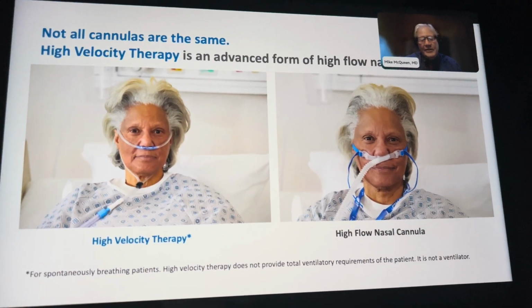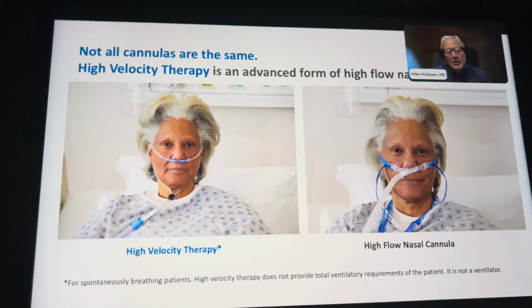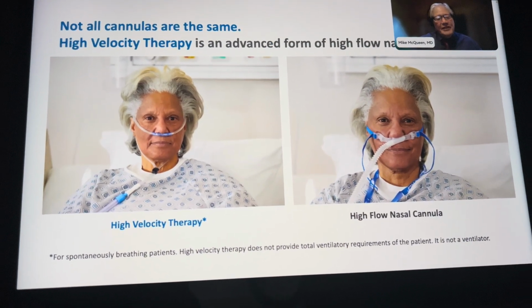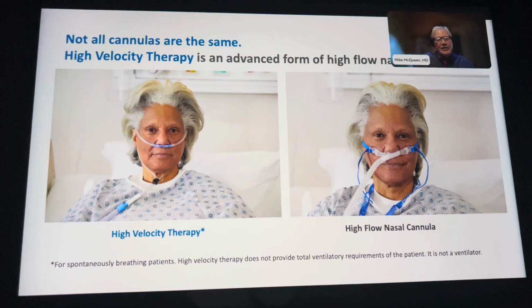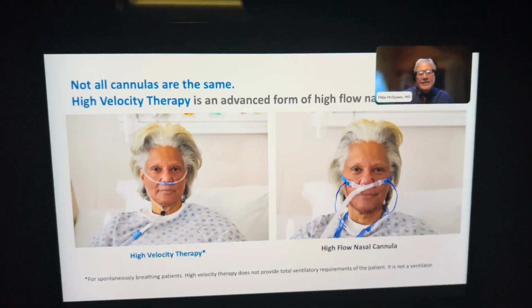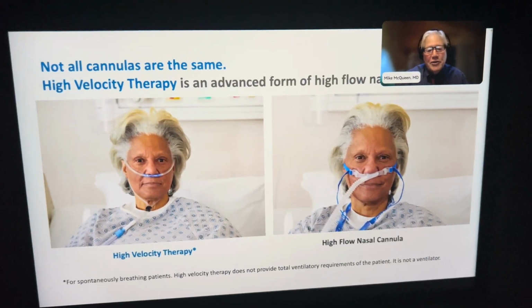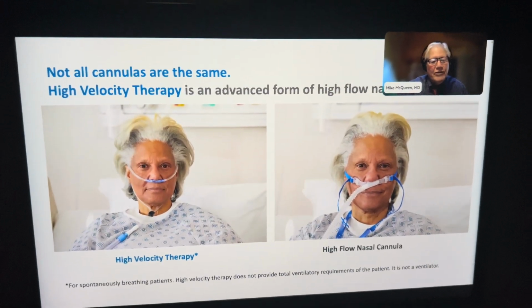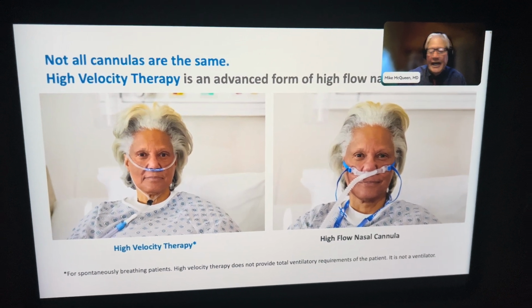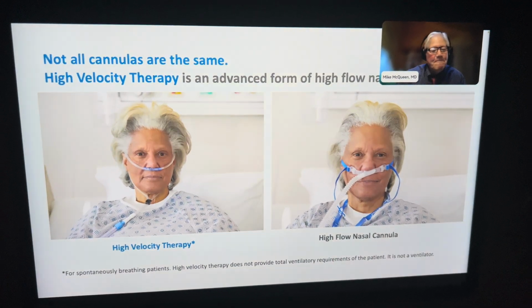And clinically, our colleagues tell us that at higher flows, the patient will sort of automatically open their mouth even without thinking about it. This provides a path of egress for that CO2 flush. So a non-occlusive, non-pressure-based interface, significant difference from the positive pressure devices. And that internal bore velocity versus flow is significantly different from the standard high flow devices. Anna, go ahead now to the summary slide.